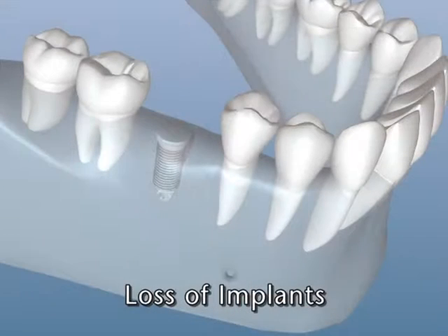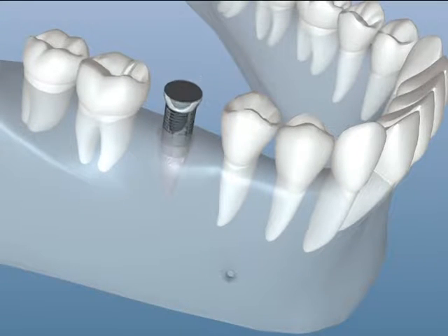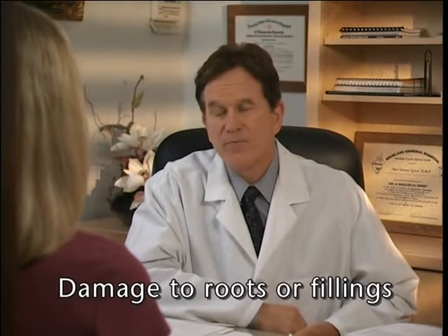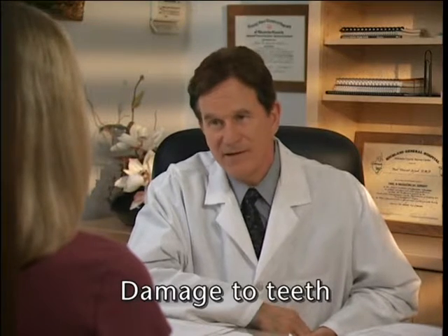Are there any other complications? Depending on the difficulty of the surgery, there are a variety of risks. These can include loss of the implants due to infection. However, if the implant is lost, we may be able to place a new one after the good bone healing has taken place. Besides swelling and bruising of the face and jaws, risks can include damage to tooth roots, which may later require root canal treatment or result in loss of teeth.